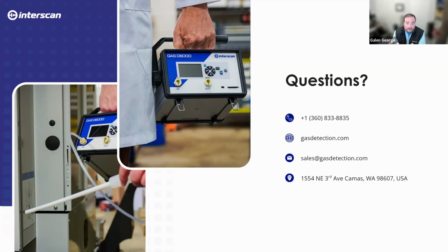Currently, emission levels testing, as I mentioned, is not really something that is continuously monitored. Typically it is up to either outside regulatory bodies or the facilities themselves to do random spot checks of their emissions. It's not something that's been closely monitored, which is why this new regulation has come out.